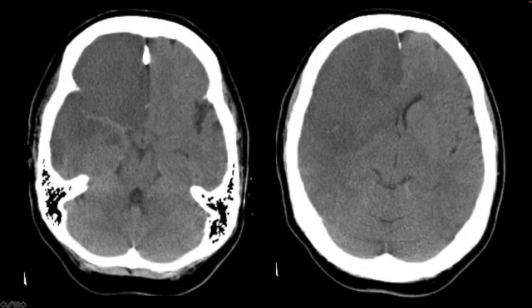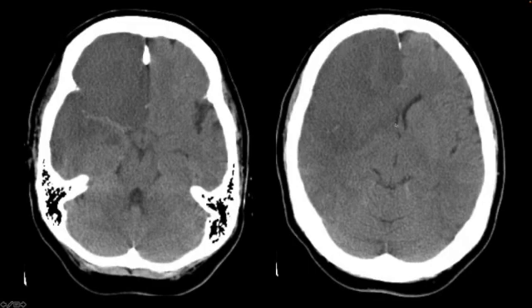A little bit later in the course here, you can see there's now a more well-defined area of low attenuation and loss of gray-white differentiation — a large geographic territory, actually involving the anterior cerebral artery and portions of the middle cerebral artery distribution. There's more mass effect now with increased sulcal effacement, increased ventricular compression, and now we've actually got midline shift from right to left.